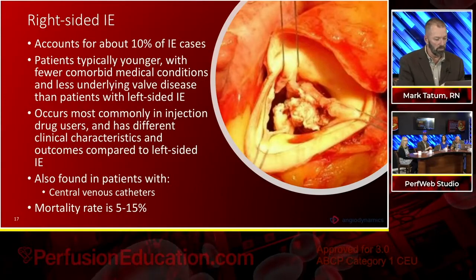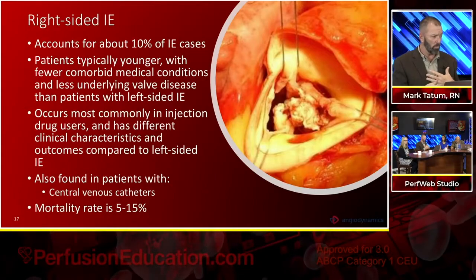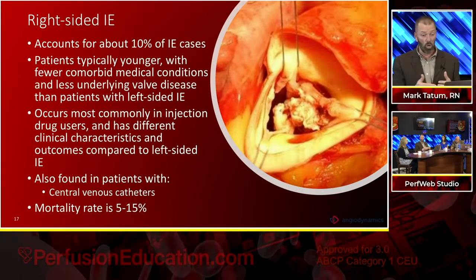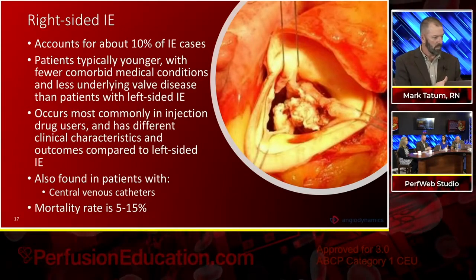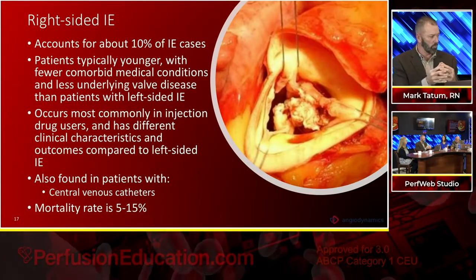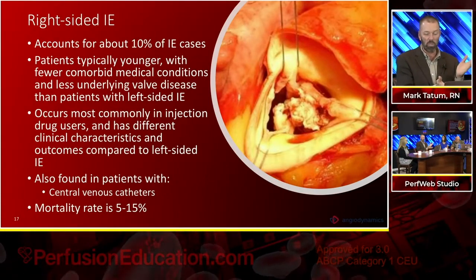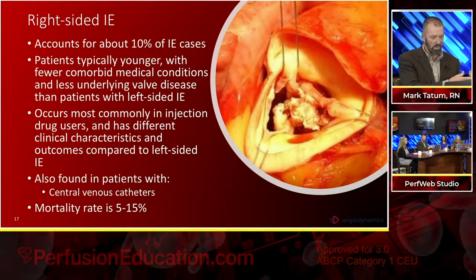One other thing I do want to mention has to do with infectious disease. One of the questions that we get quite often, especially when we're talking about involving ID, is how is this going to change my practice? If we're going to engage them, they want to know why this makes any difference to them. In some cases, we have taken the material, captured it in a filter, and sent that material to the lab, and the lab does their culture directly on the material as opposed to the blood. And we have had instances where they grow out between 1 and 4 different types of organisms that were not found in the blood cultures.